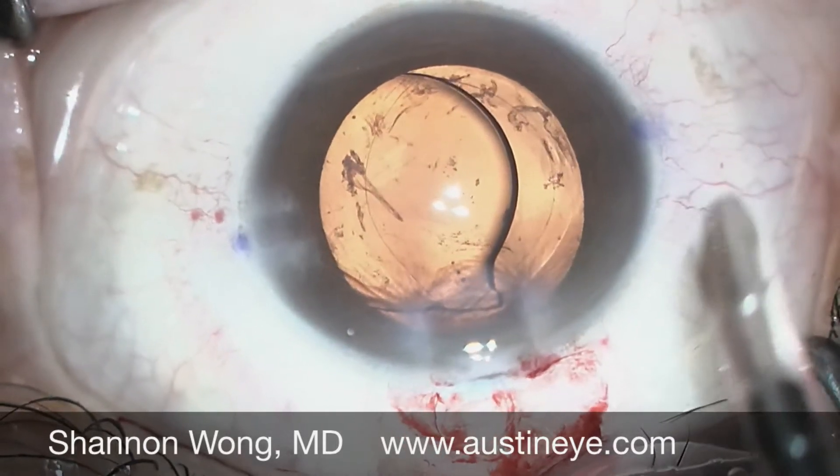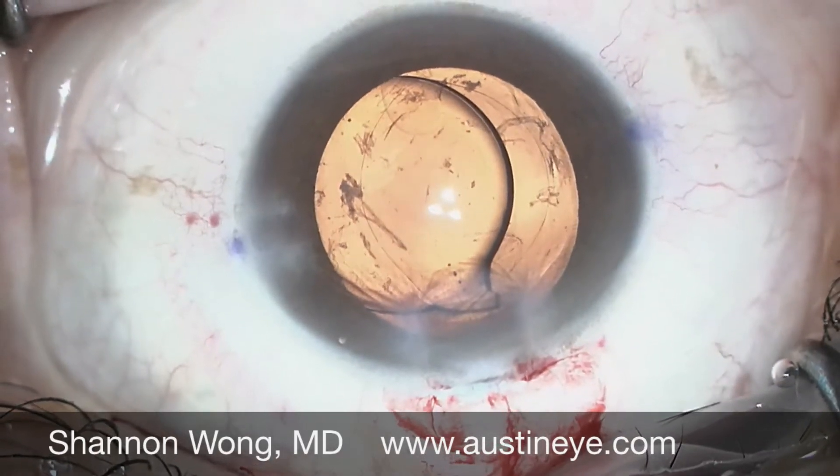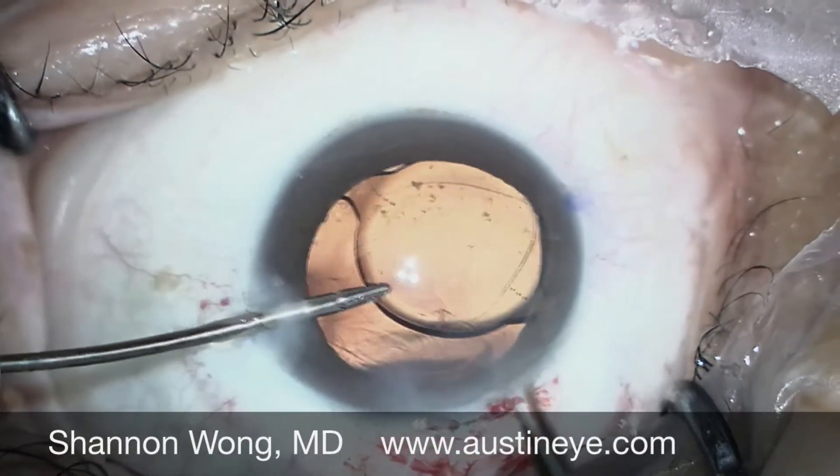There's a notch in the insertion tip of the platinum inserter that did not capture the trailing haptic.